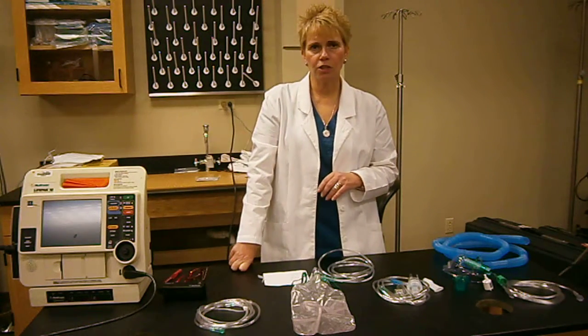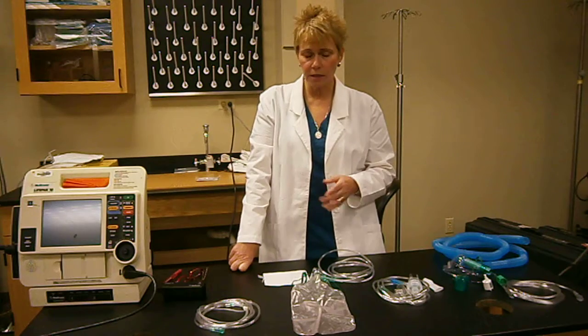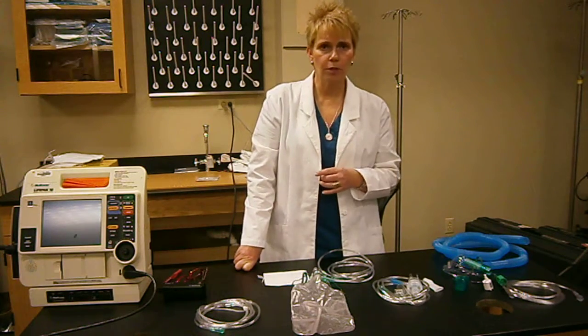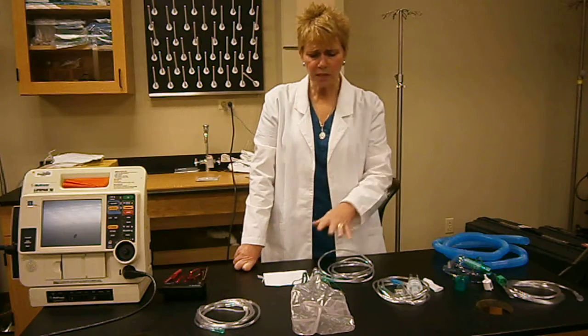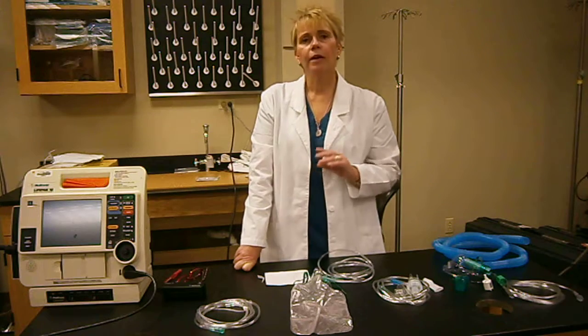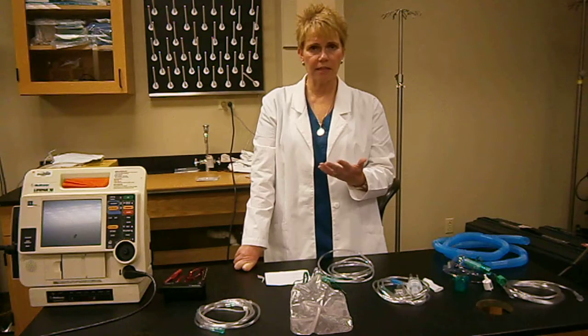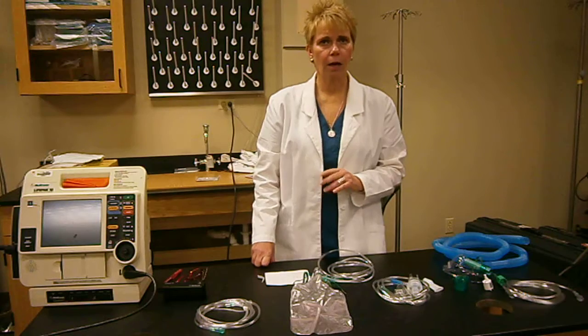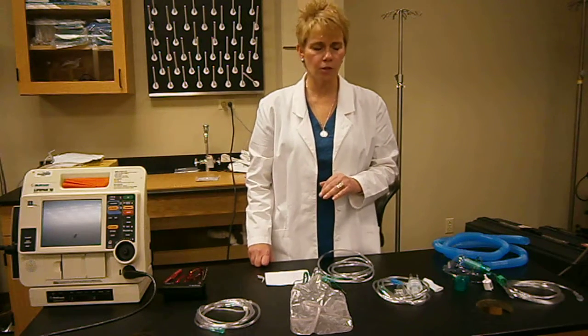The next type of oxygen modality that you may use, but you may not use, is a simple face mask, which I do not have here, but it's similar to the non-rebreather. What you need to be cautious of when you're using a simple face mask is because it's in an enclosed system, similar to the non-rebreather, if you do not turn the oxygen level up high enough to probably at least 6 or 8 liters, the patient can rebreathe that oxygen that's already collecting in the bag, and they can become hypercarbic. So we actually don't recommend that you use simple face masks because sometimes there's untoward effects as a result of them.